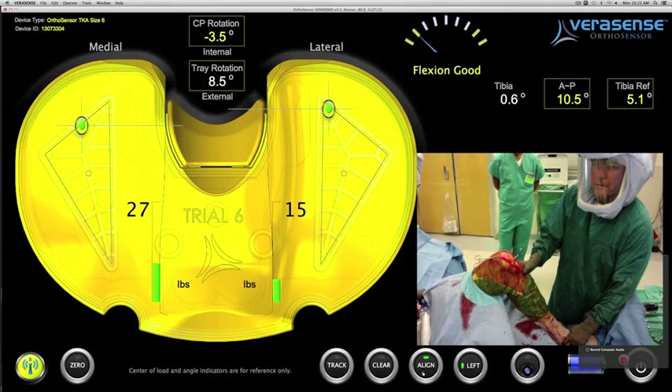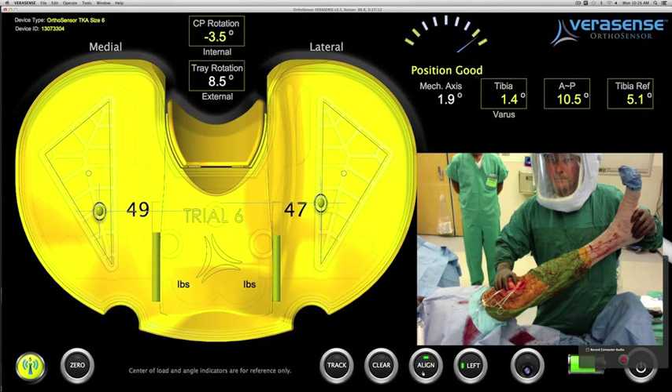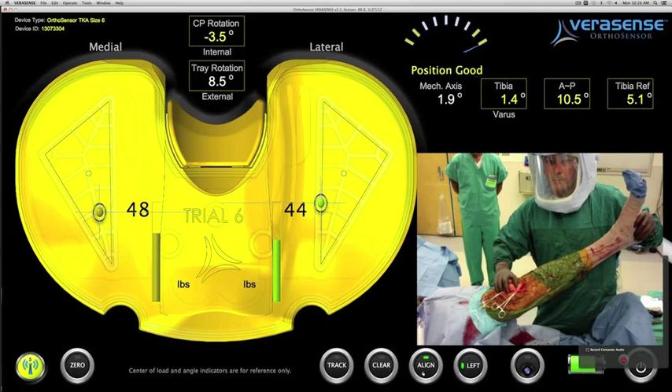By rocking once again the center of the ankle through the knee joint, the accelerometer tells him that he has improved his cut to 1.4 degrees of varus.